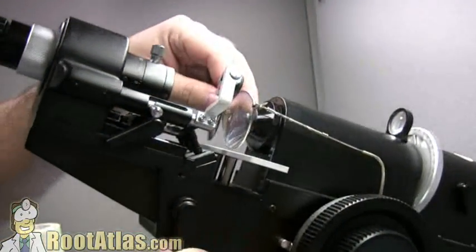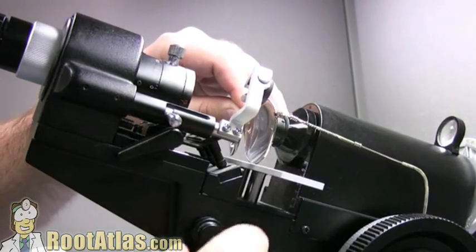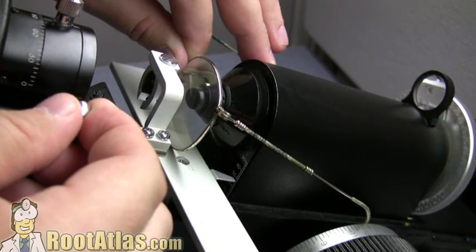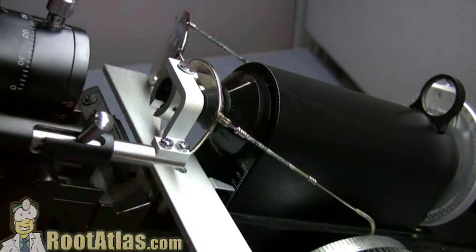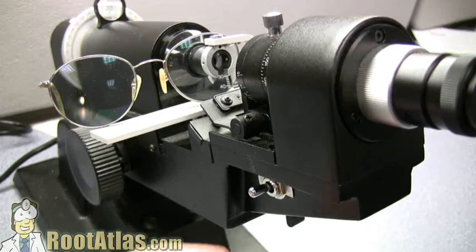The first step is to put the glasses in the frames here. You can see this platform moves up and down, and you want to put the optical center of the lens such that it aligns here. This little brace holds the glasses in place. Make sure both lenses are touching the bottom of this platform.